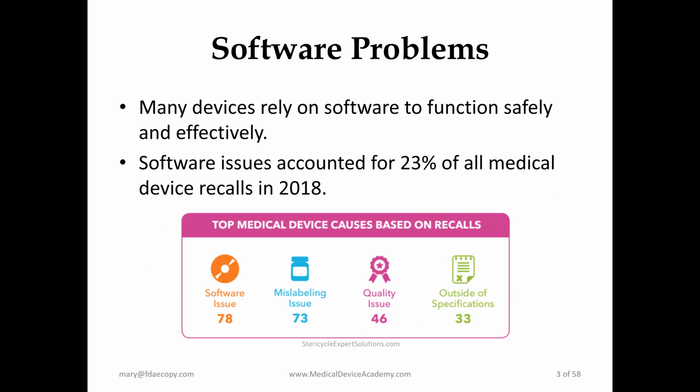So like Rob was touching on, the vast majority of medical devices these days seem to have some element of software, and they rely on software to function safely and effectively. And in turn, software issues account for a good chunk of all medical device recalls and medical device issues.